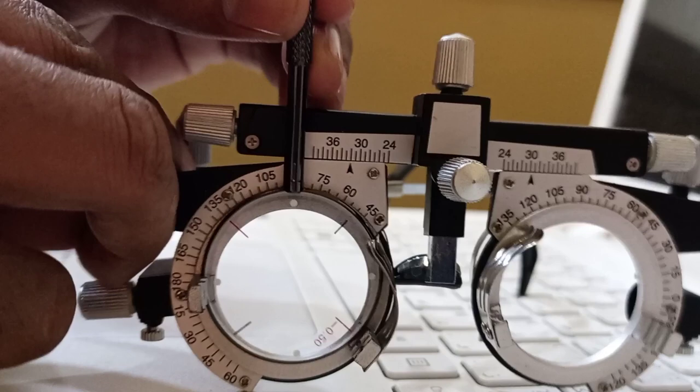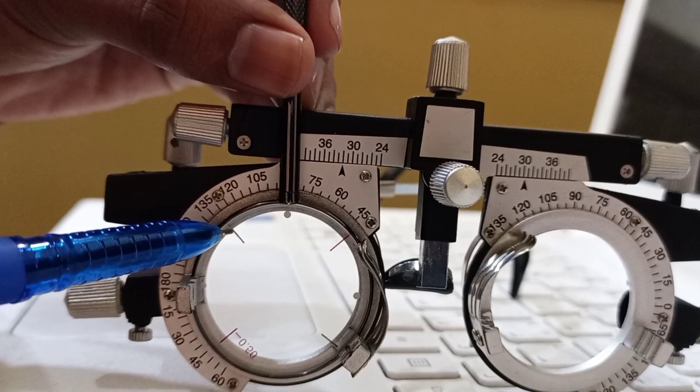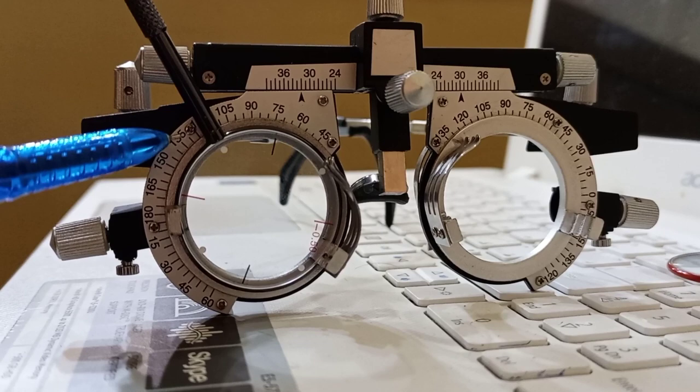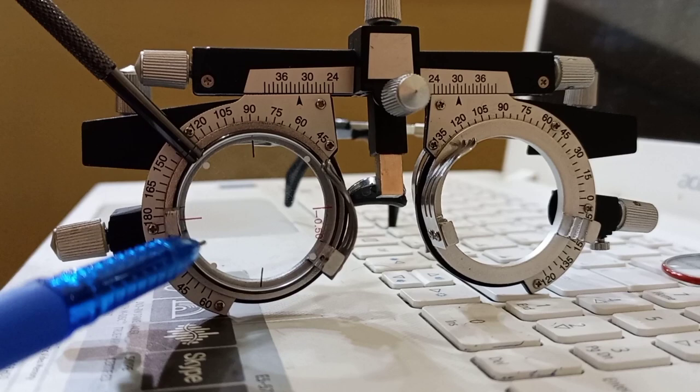The handle can be flipped, so when I flip the Jackson cross cylinder at the same position, the minus line is at 45 degrees and the plus cylinder line is at 135 degrees. When I place the handle at 135 degrees, the black line which is the plus cylinder axis is coinciding with 90 degrees, and the red line of the minus cylinder axis is coinciding with 180 degrees.